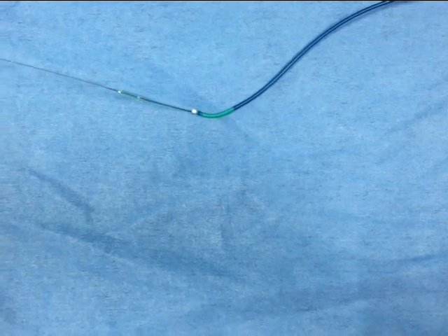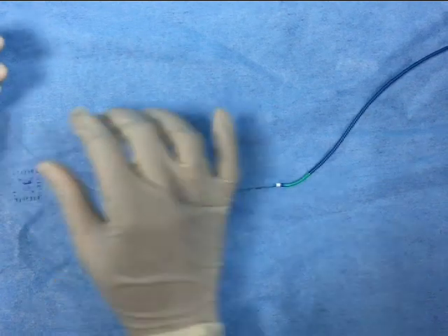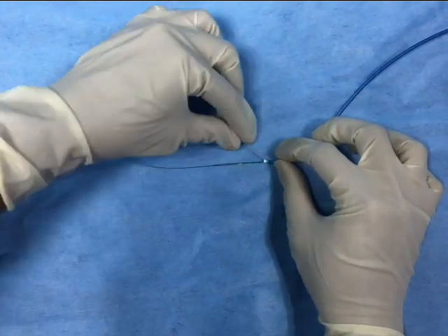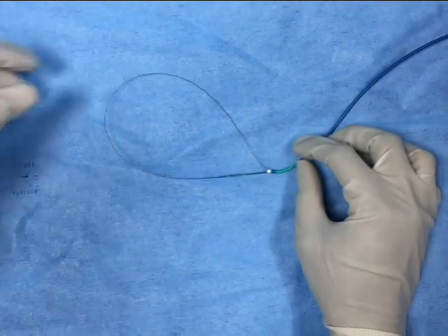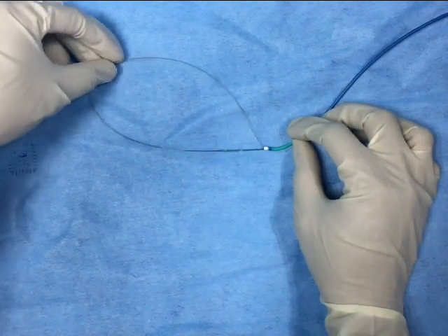Once it reaches beyond the catheter, make a loop using the soft tip of the O14 wire and insert it back into the catheter, so we will get a loop.